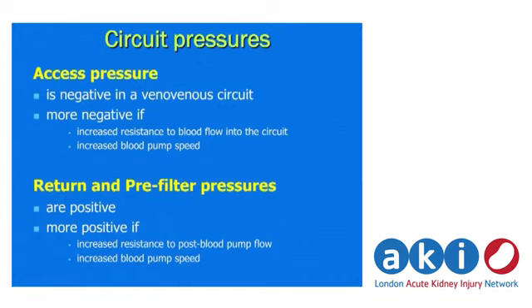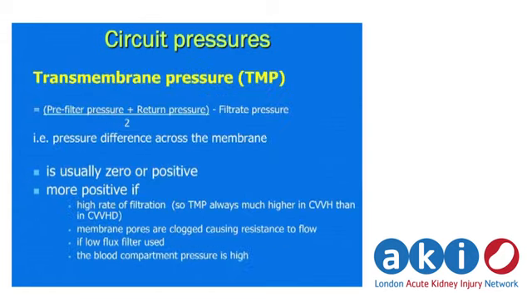And on both of them, the blood flow is all to do with the quality of the access and the way the line sits in the vein, and whether there's any kinking because of patient movement or the anatomy of the patient. Although, and I should have brought a dialysis catheter with me, the manufacturers make huge efforts to make catheters as kink resistant as possible, with the holes as carefully designed as possible to avoid them being blocked, and the shape of the lumen designed to avoid turbulence and things that can cause clotting. But that's where the problems can arise.